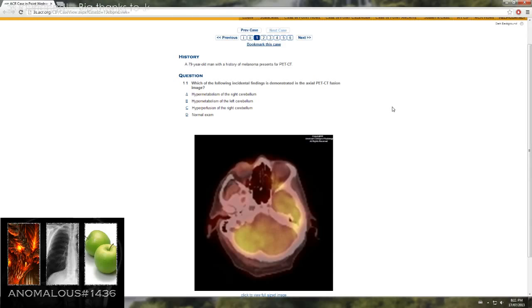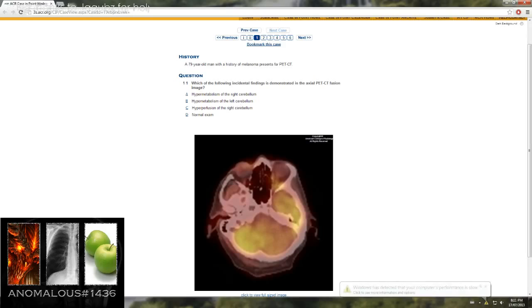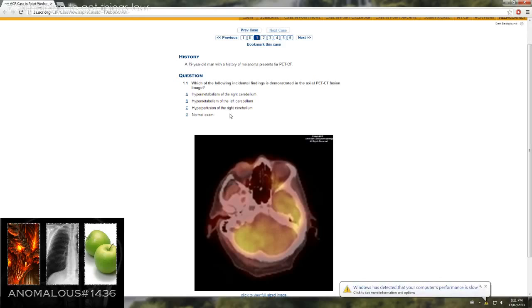Hypermetabolism in the right cerebellum, hypometabolism in the left cerebellum, hyperperfusion of the right cerebellum, or normal exam.